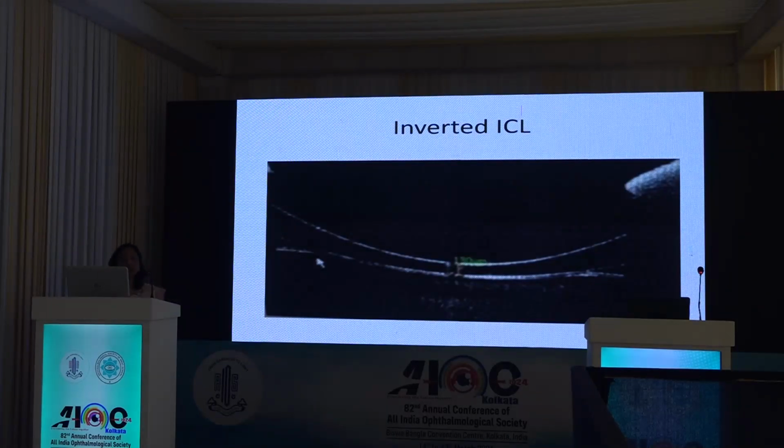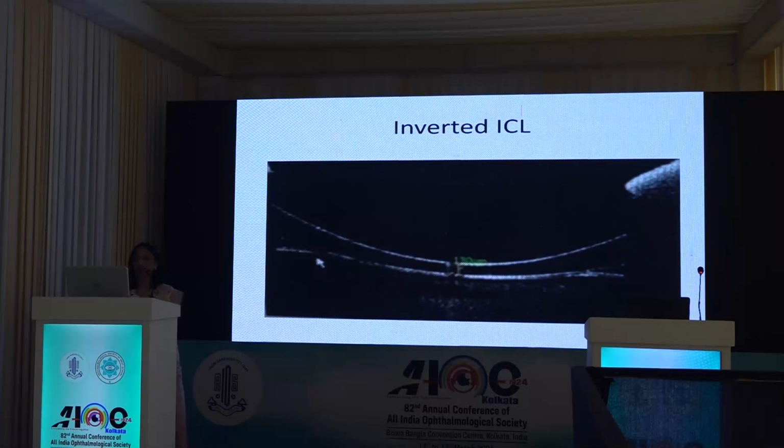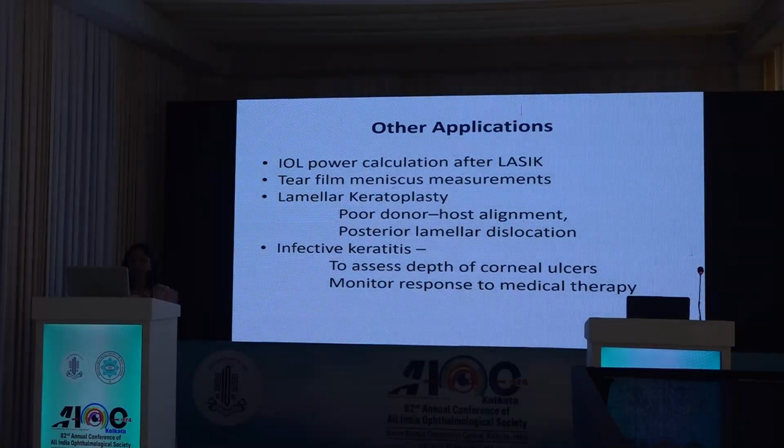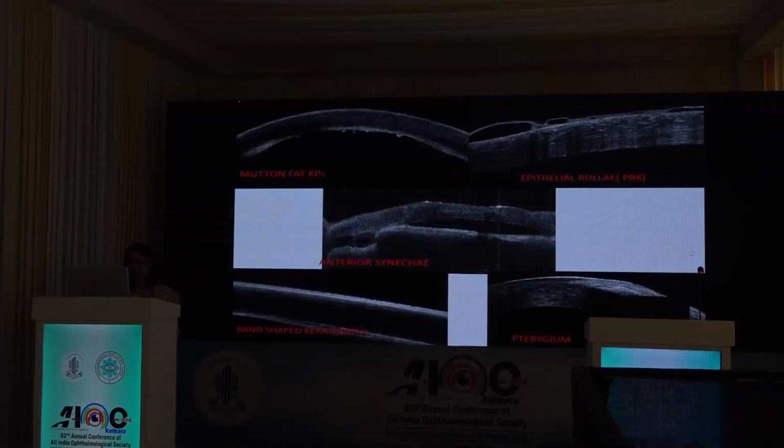Now, this patient had an inverted ICL. So the surgeon didn't realize when they saw the patient on day 1, and they confirmed that on the AIOCT, and we had to take the patient again to OT, explant and re-implant the same ICL. So there are a lot of other indications like tear film meniscus measurements, IOL power calculations, and in infective keratitis also it's very useful. So it's not possible to cover all the indications and applications in one go.